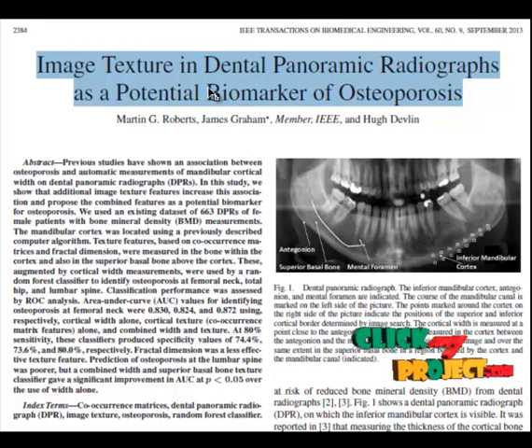Our proposed method uses a Gabor feature extraction and SVM classifier. SVM gives higher accuracy and sensitivity. We used the Gabor feature extraction method and multi-SVM classifier for different ages. A set of Gabor filters with different frequencies and orientations is used for extracting useful features from an image.